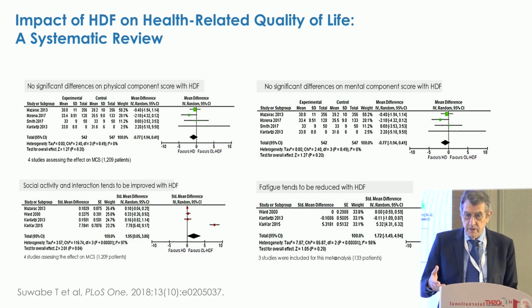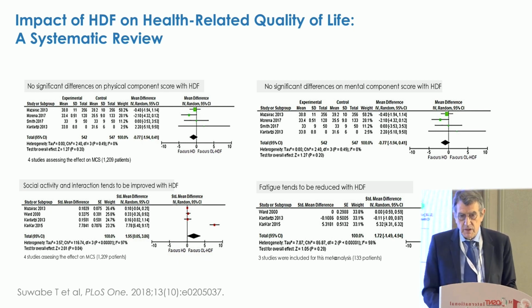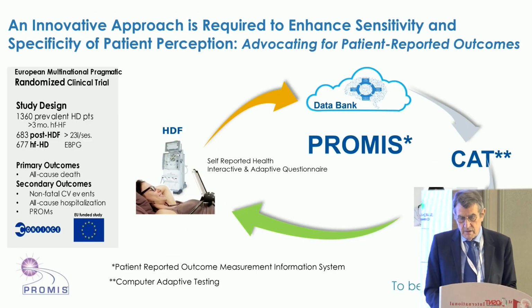Now, if you look on the hemodiafiltration, we are missing some information, but still some systematic review already on the health-related quality of life show that there is a trend. Beneficial effect on fatigue, not really on a mental component or physical component, but there are some trend in this aspect. And again, linked to the CONVINCE.